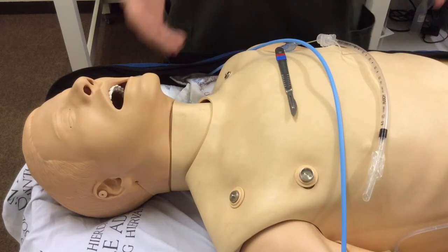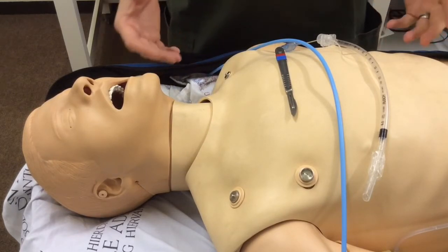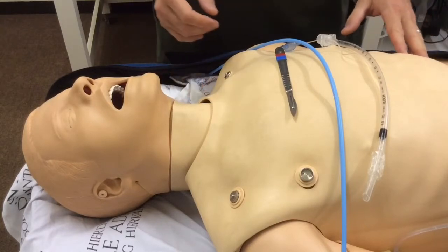So obviously we're going to be in a can't intubate, can't oxygenate scenario. We're going to have tried other options and recognize that we're unable to oxygenate this patient without going to front of neck access.